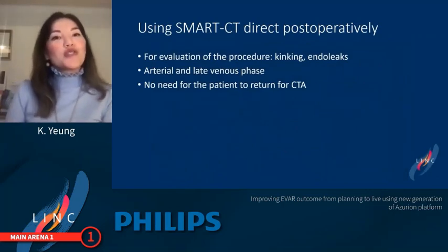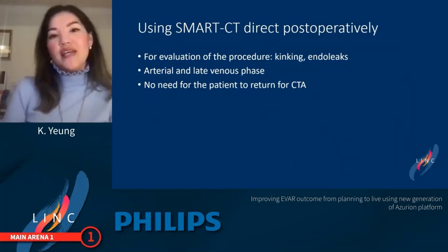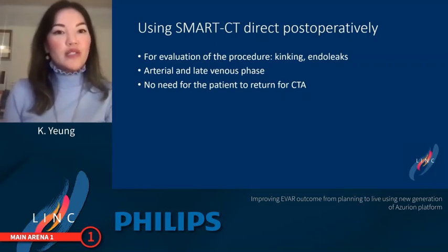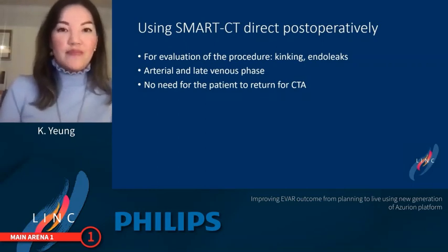We also used the Smart CT directly post-operatively for evaluation of the procedure. Was there any kinking or endoleaks in the arterial and late venous phase? You can evaluate type 1 or type 2 endoleaks. And there's no need for the patient to return on short term for a CTA.